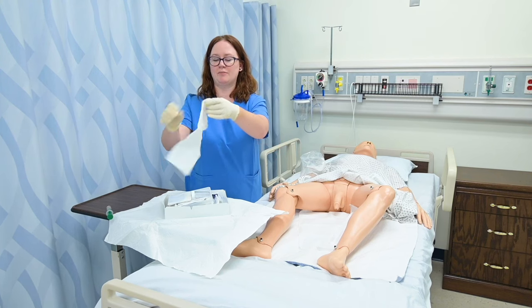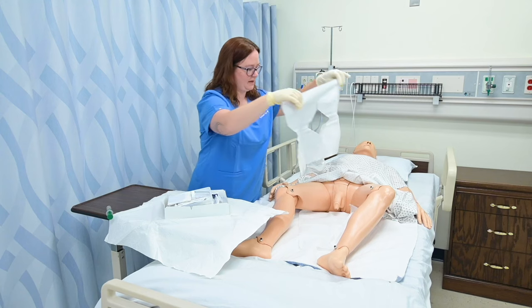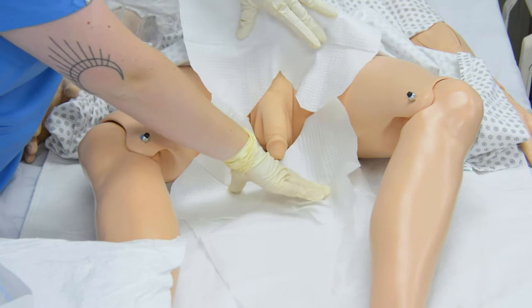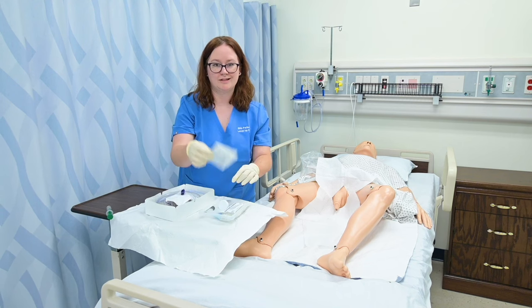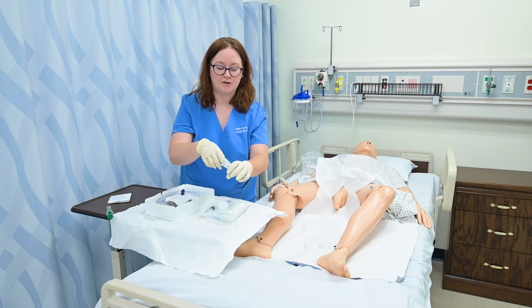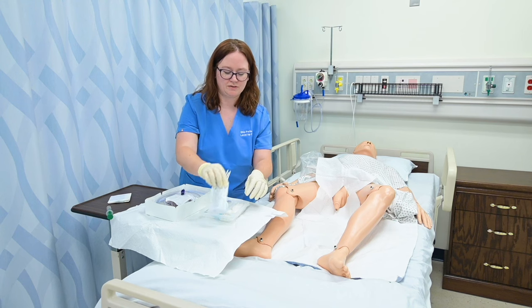I can then grab my fenestrated drape and place that over the penis. These are simulated swab sticks, meaning they don't have the betadine or coloring on them, so they're safe for my mannequins — but in real life these would be a dark orange color usually. I've opened those and prepared those for my use.